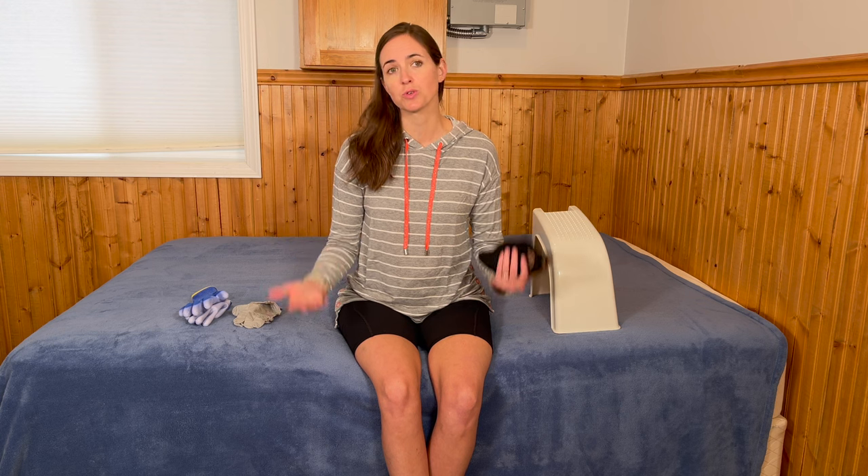Hi everyone, it's me Lindsay with EquipMeOT here today to talk about compression sock donning techniques and tools. This is an update to a previous video that I did, going to include several more strategies and an additional tool that you could use for yourself, for a loved one, or for a client to assist them with getting their compression socks on.